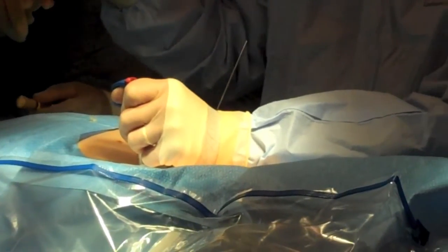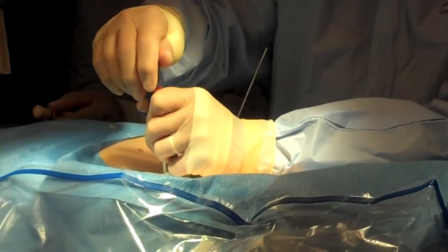This is best suited for somebody who has pain that's isolated to the joints, not pain that's generalized in the spine, not pain that is involving nerve roots or discs. If the pain is very specifically from these joints in the back part of the spine, this can be a very good procedure. We try not to do it on very young people.